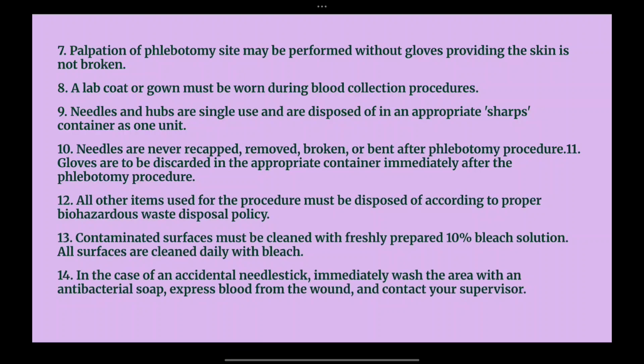Ninth safety tip is needles and hubs are single use and are disposed of in an appropriate sharps container as one unit. So needles and the hubs of it, that is the region where the needle connects with the syringe, both of these are single use and should be disposed of appropriately. That is, they should be put in a sharps container only. You can't throw them in different containers.